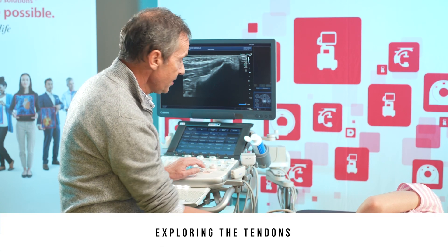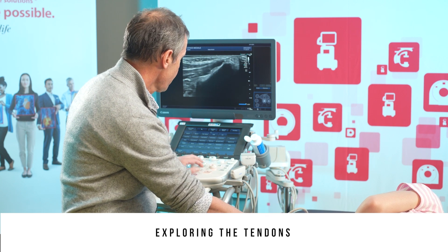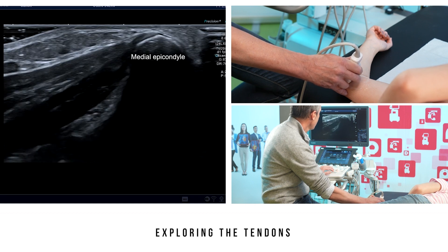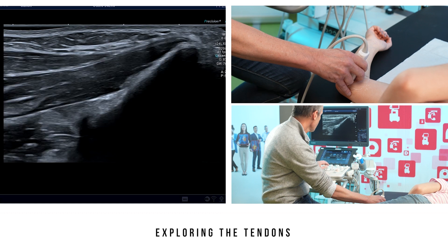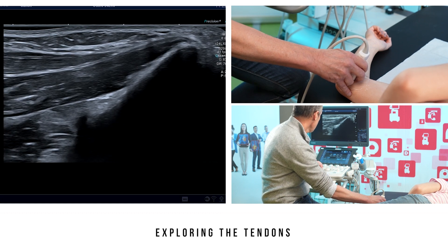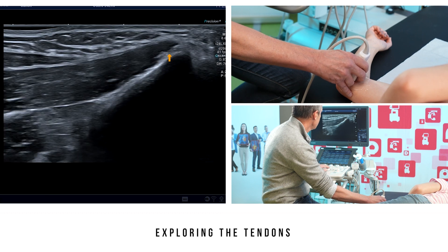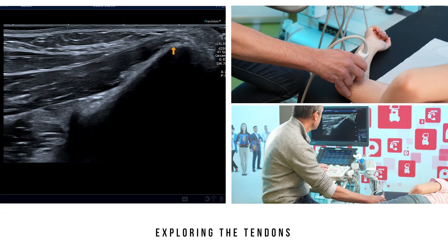Once the bony landmarks have been identified, it will be easier to analyse the tendons. We find the medial epicondyle, which is rounded, and then the most proximal tendon, which has a very proximal musculotendinous junction. This is the tendon of the pronator teres, inserting on the supracondylar ridge.